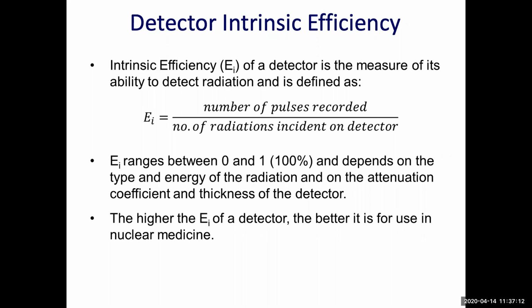Let's start with the detector intrinsic efficiency as well. Radiation detector quality is expressed in terms of efficiency or sensitivity, energy resolution, dead time, and also counting rate performance.